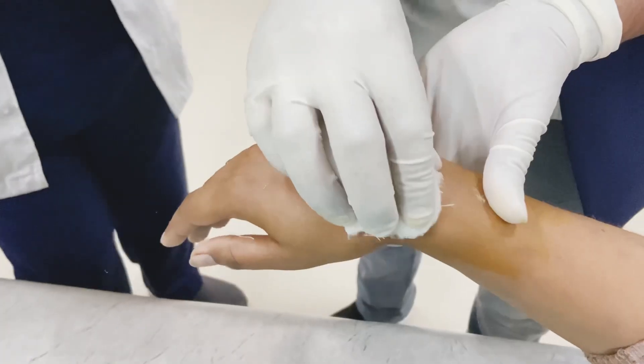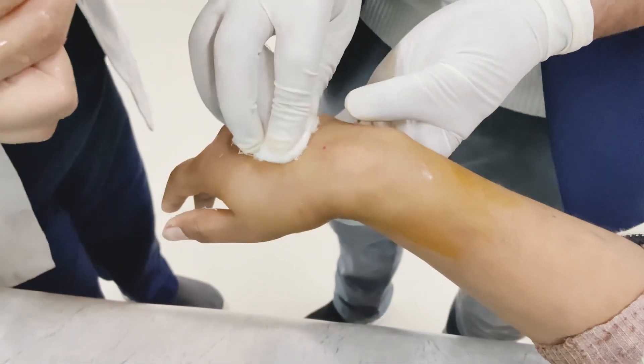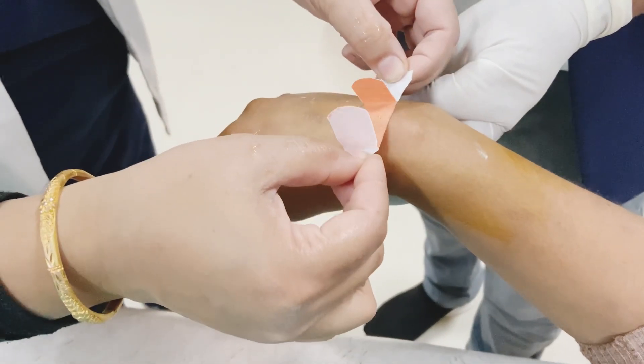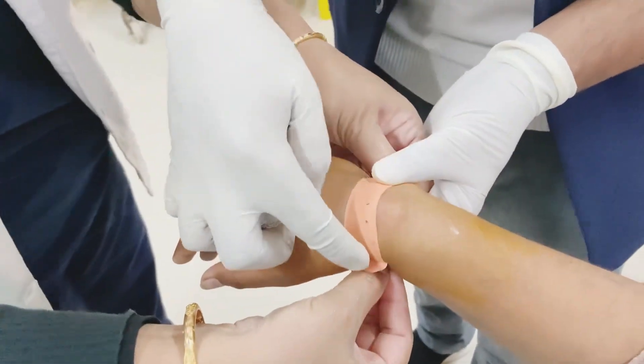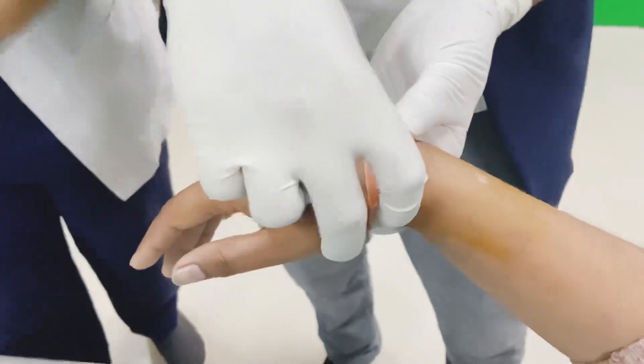This new swelling will resolve within 2-3 days. Now seal the wound and do some movement over the wrist joint. This is the end of the procedure.